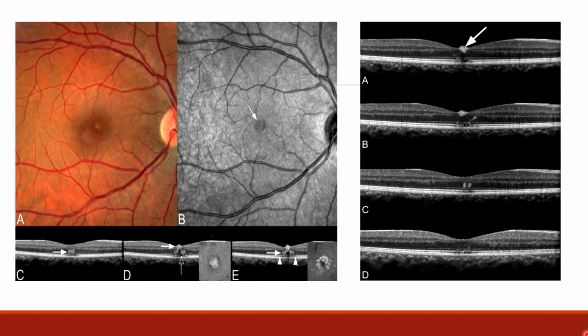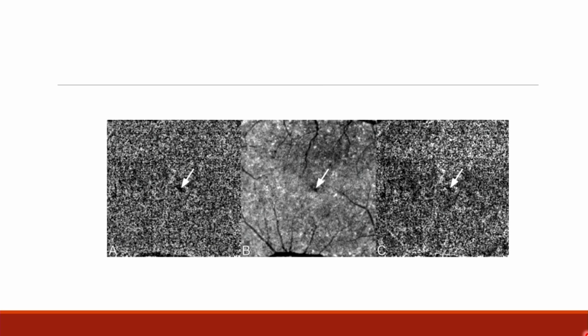And this was the final OCT of this patient. The vision became 6/6 and subtle discontinuity was present. Otherwise, the lesions had completely resolved. This was the OCTA image of the index case in this series.